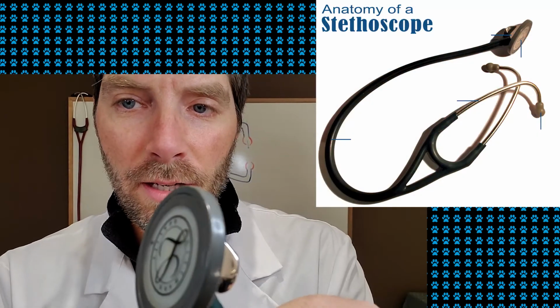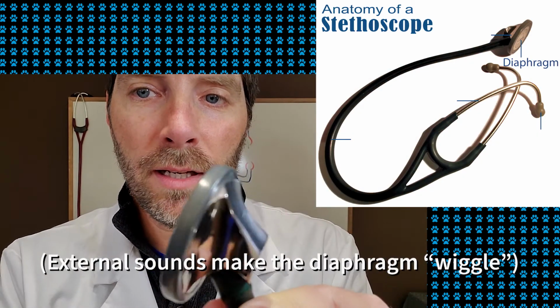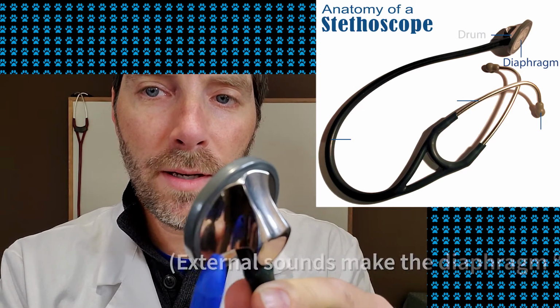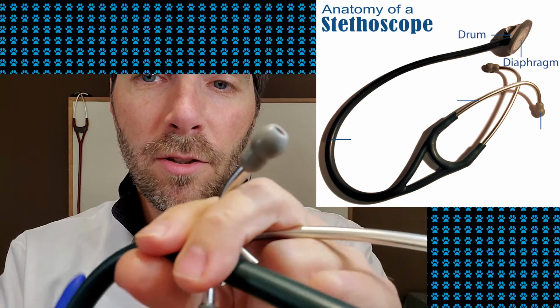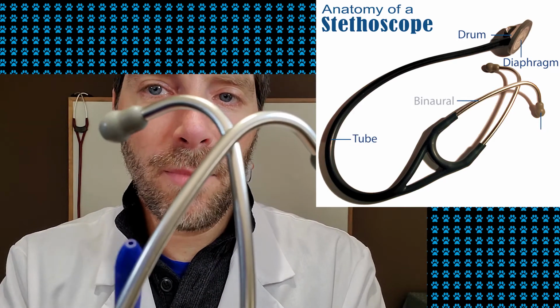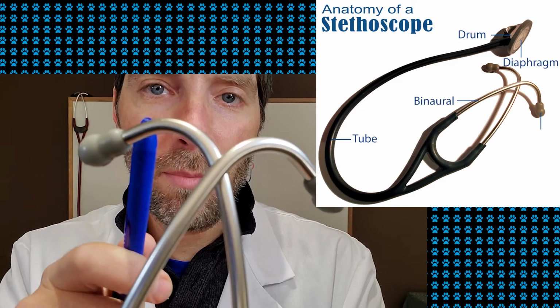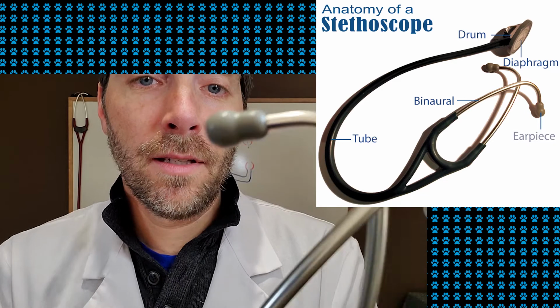So to get acquainted with the stethoscope, let's go over the various parts here. To start with, this is the bottom part that we listen to your pet with. This here is the diaphragm. That is the part that wiggles. And in here, we have the drum. That is the part where the sound is amplified. The sound moves down the tube into the binaural. That's the metal pieces that have the nice bend here that pokes into our ears. And then out the earpieces here.